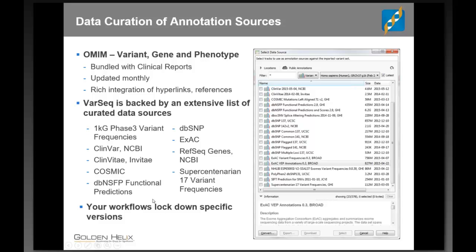Finally, as you get all this information into your project, we're locking down to a specific version of ClinVar. We get all this data offline. You're never sending your variants from your lab to a cloud server and having to be concerned about the privacy concerns of having that data transmitted back and forth. This all stays local to your institution.